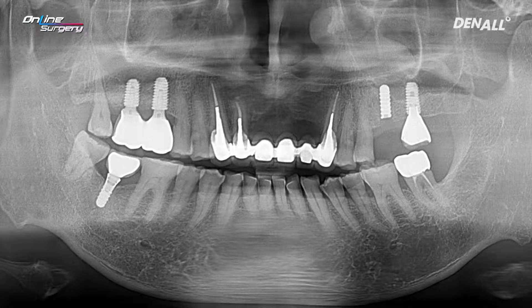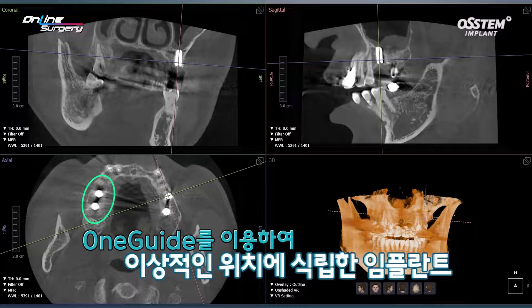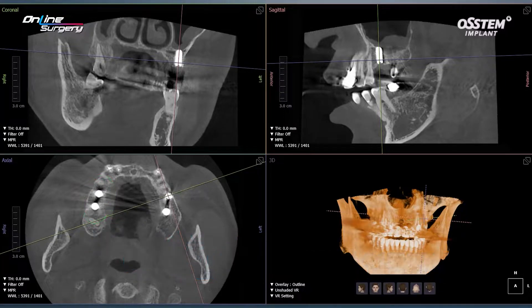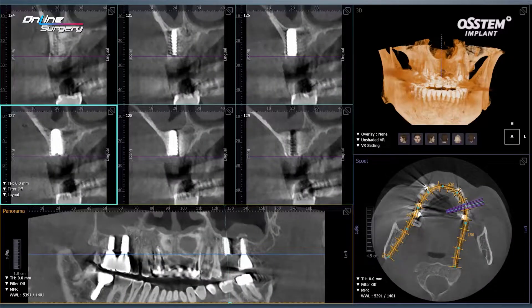I checked the CT once again. Compared to the implant that I placed using OneGuide, which is nicely placed within the alveolar bone, not only is the S implant thin, but it is buccally inclined. On CT, although it is buccally inclined, the buccal plate had not melted away yet.